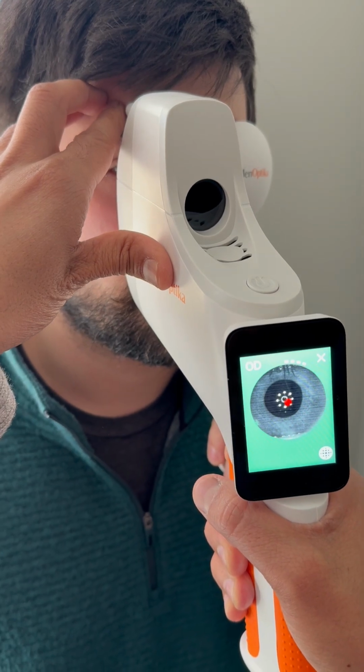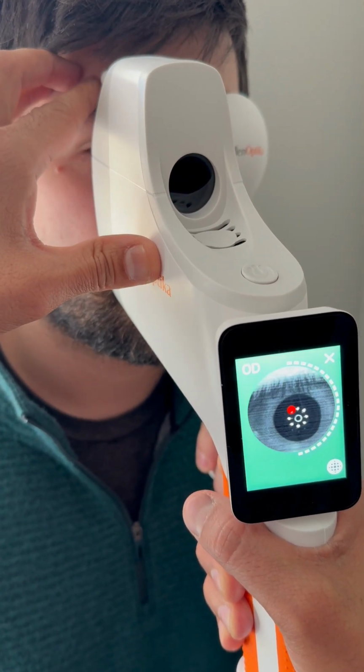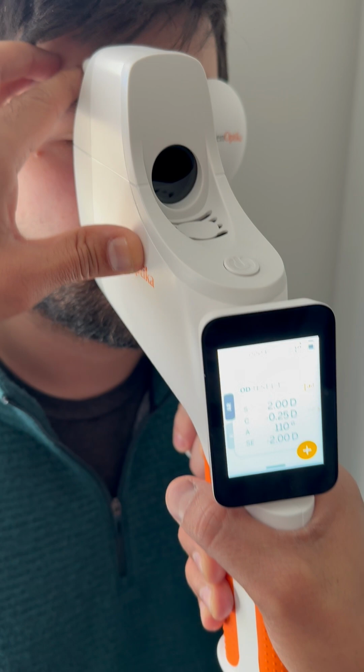Okay, so I'm going to show you some of the new features of our companion app, particularly the detailed results that you can get in the companion app. It's very exciting. So first we're starting with a measurement on the QuickSee Free Pro. As you can see, it takes about 10 seconds.